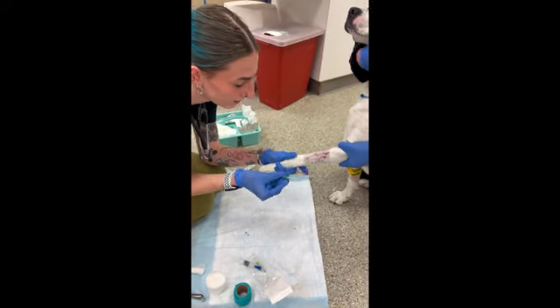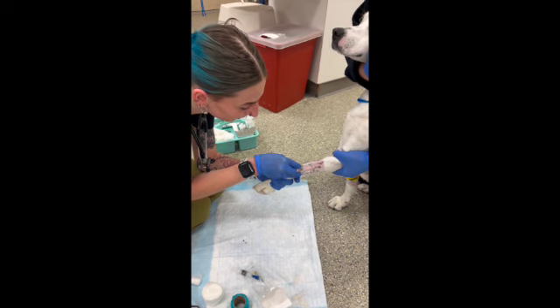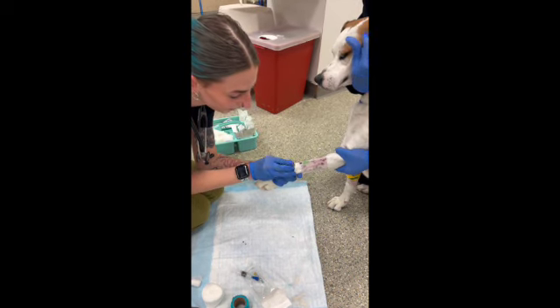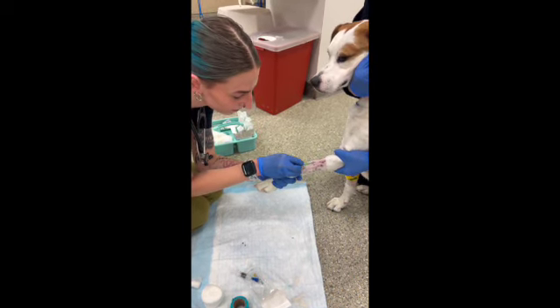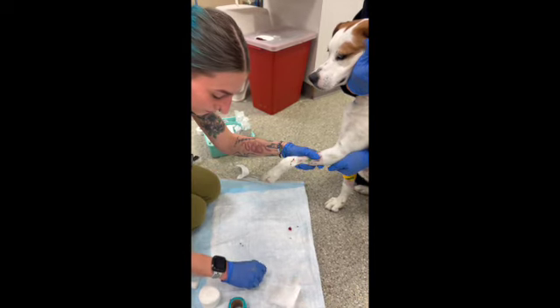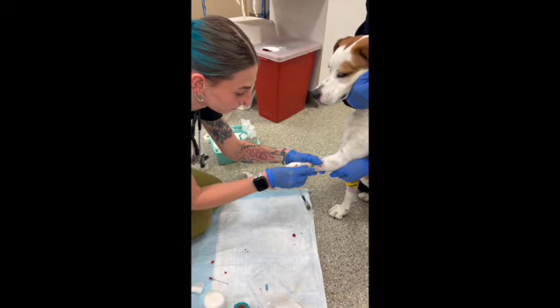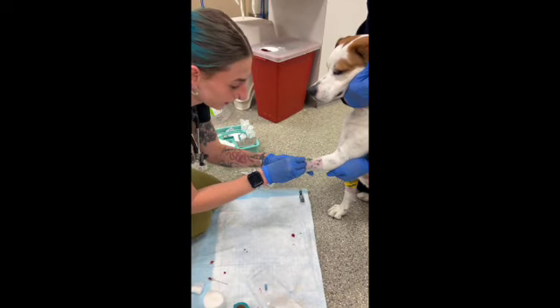Make sure my bevel is pointing up. I'm going to insert my catheter. And I'm getting blood there, so now I'm just going to advance. I'm going to connect the T-port there.